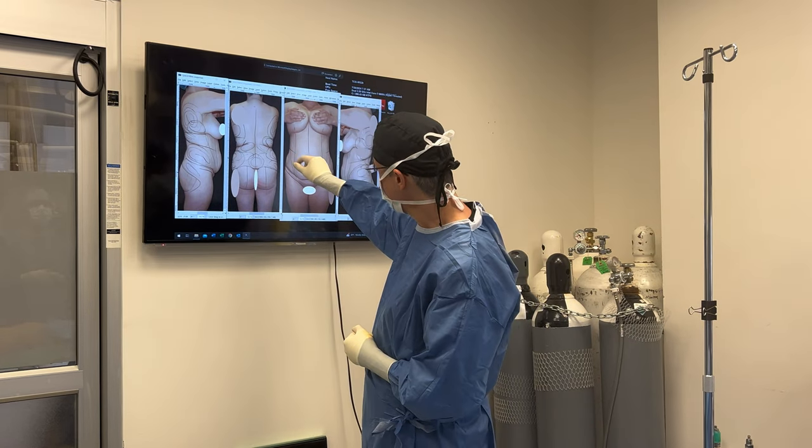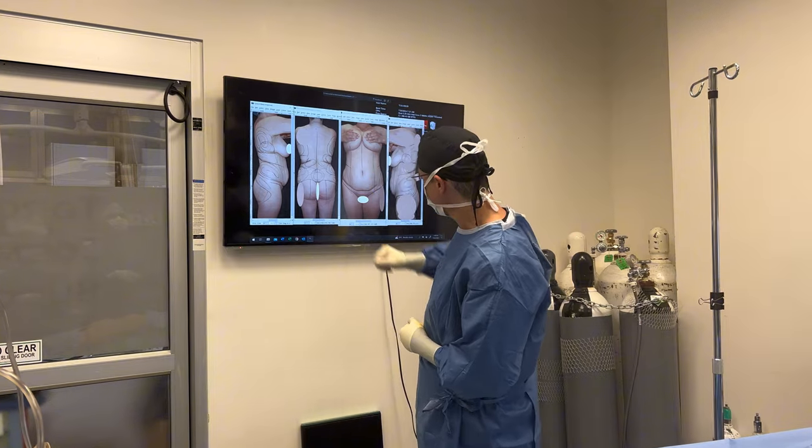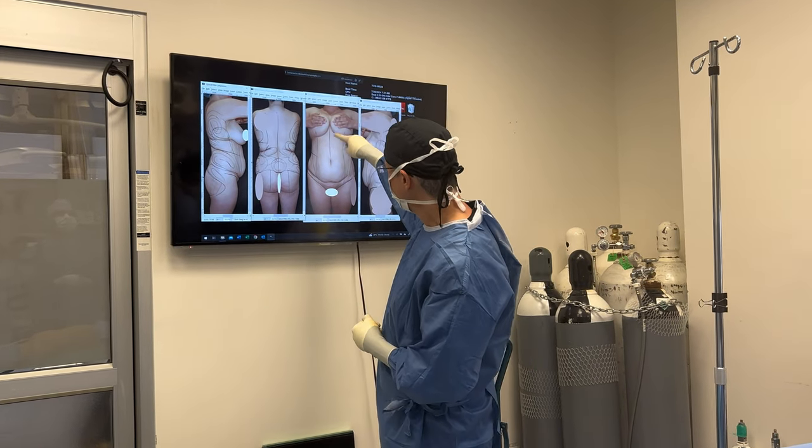Most of her weight is in the midline. We're going to liposuction the love handles, flanks, and tummy. I'm going to leave the upper tummy intact because we're going to be coming back to do a tummy tuck, so I don't want to create any scar tissue here.